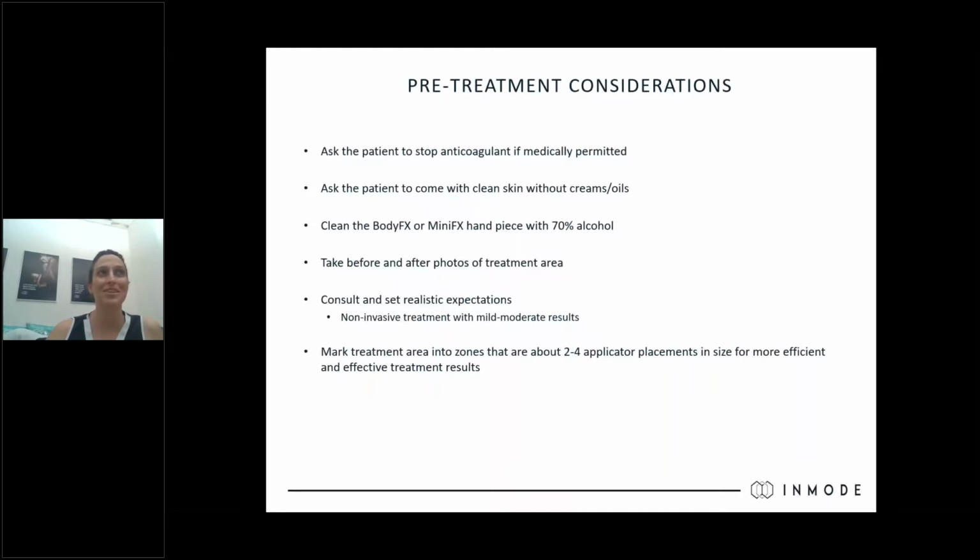Explain to your patient that we're treating a localized area. Okay, so it's not about solving their entire eating disorders issues using these applicators. But if a patient is not happy about her cellulite appearance or her inner thigh or just the submental area or just a little bit of bulging tummy, something like that can be treated. So we're not treating an overall oversized patient.